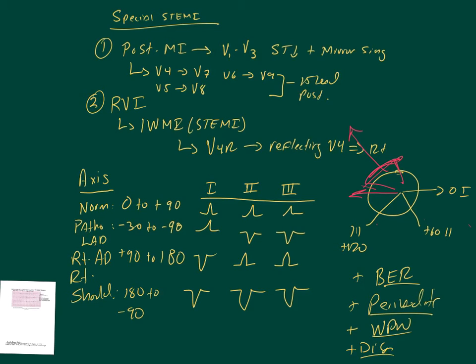It's a little more nuanced than that, unfortunately. I'm not going to get into it today, but there is something called Sgarbossa criteria. We actually use that to examine the ST elevation in patients with left bundle branch block. And we look for different types of what's known as concordant and discordant elevation, elevation that goes along with or against the direction of the QRS complex. And there are different thresholds based on concordant and discordant morphology of the ST segment compared to the QRS. That's just something you want to throw in the back of your mind, that it actually is a little more detailed than just, oh, treat them all like they're having STEMI.